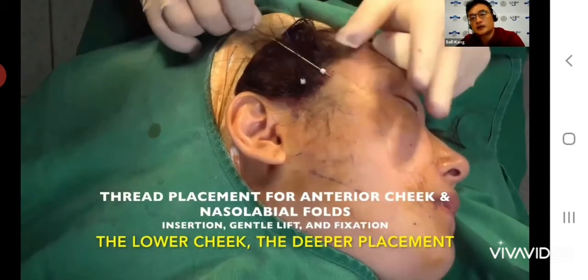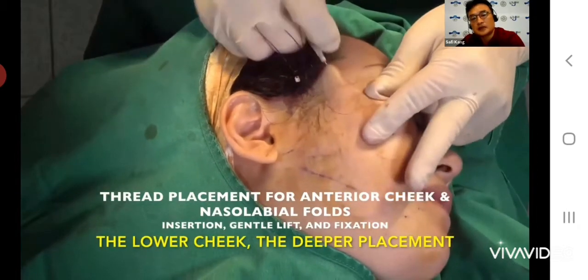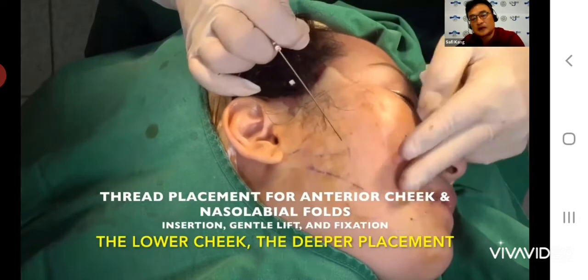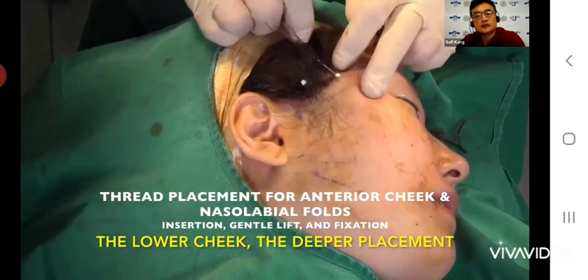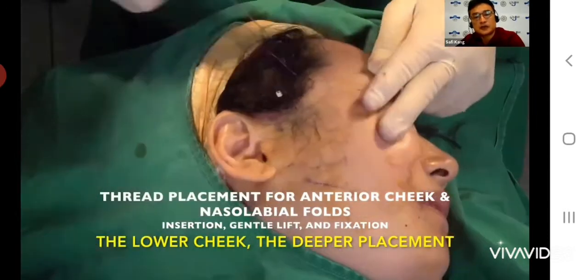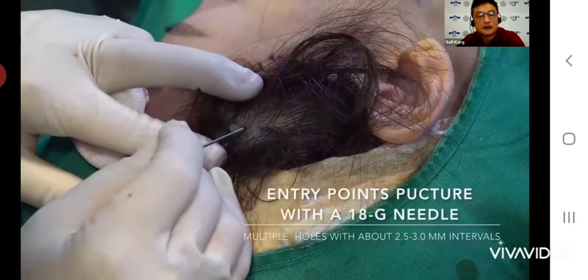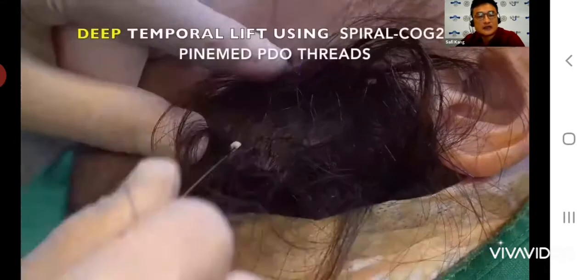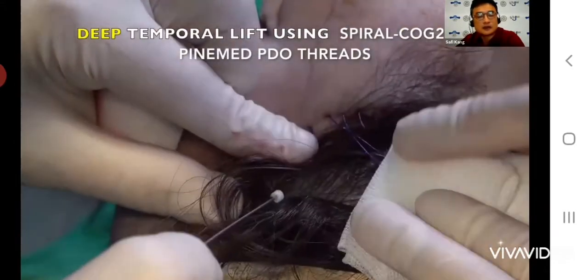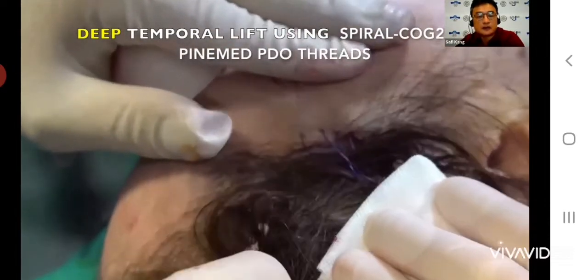So now I'm inserting the thread for the mid-face lift. So you can see not right hand but left hand. Left hand's assist is very important. So here you may have experience to place the thread into this area, but sometimes you have some difficulty to thread into the deep plane. So at that time you can use not right hand but left hand, so you can control the depth of thread.